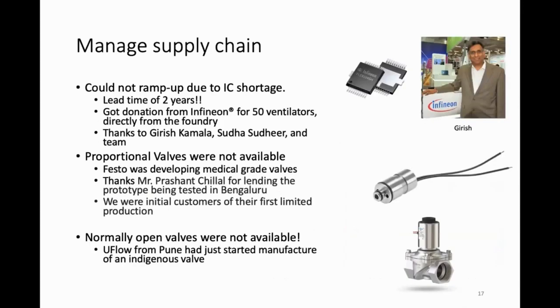You have to then start managing supply chain. You had a design, you had an electronic design, the board worked, but is it manufacturable? For that, when we started looking in, can you actually get 20, 50, or 100 of these components? The answer for many of those components was no. There was an IC shortage going on. It was pretty severe in 2021. So we actually had to make changes in the design, not based on what we want, but based on what we can actually get. People in the industry would call that managing supply chain. We were just learning it on the go.